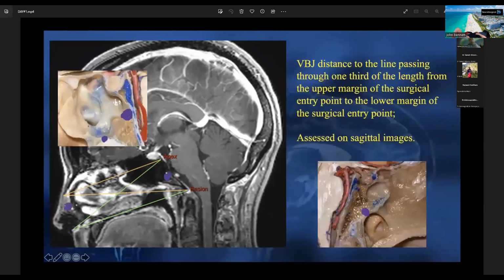Although the floor of the sphenoid sinus was straightforward in most of the cases, in 100 cases, as you would imagine, we had variation. So here, where is the floor? Is it here or at this point? And here, the similarity. So we really wanted to find this point, the point where the floor hits the clivus.